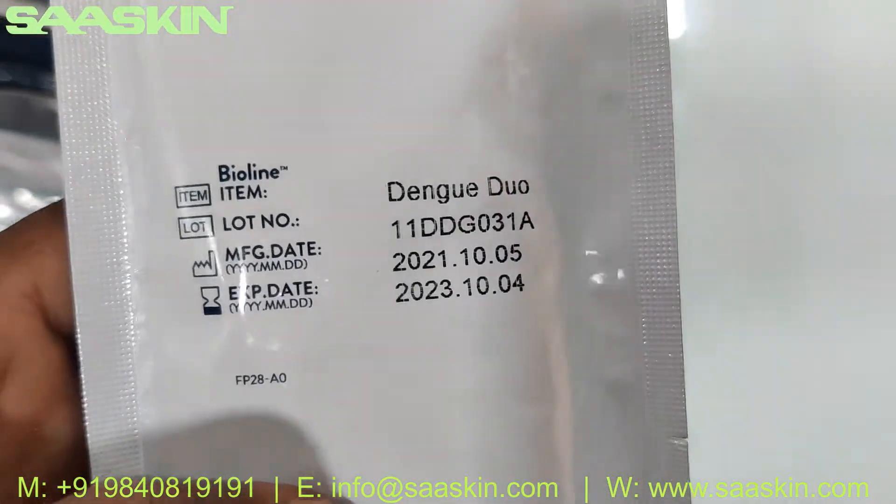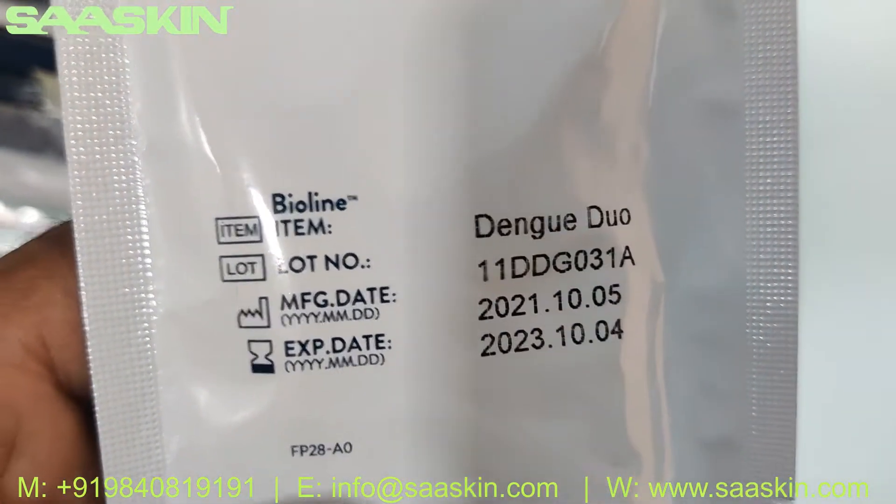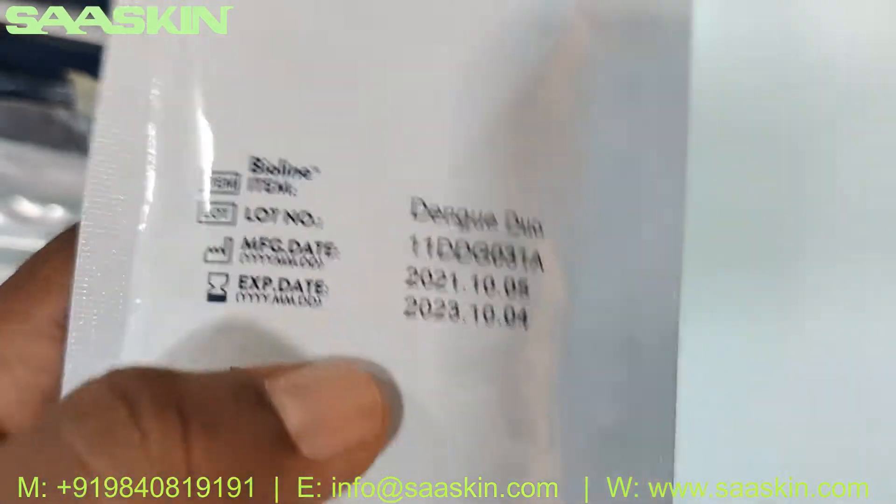You can see this is 2 years of expiry on the cassettes.